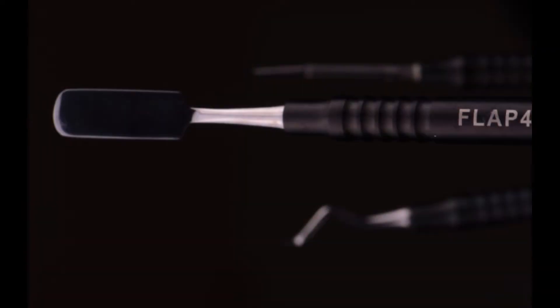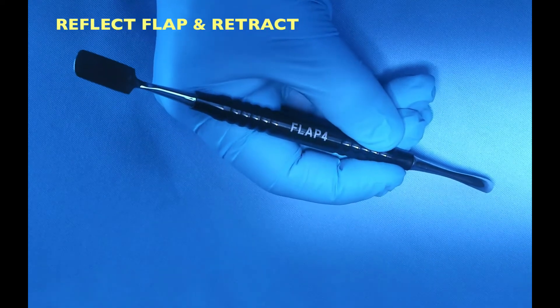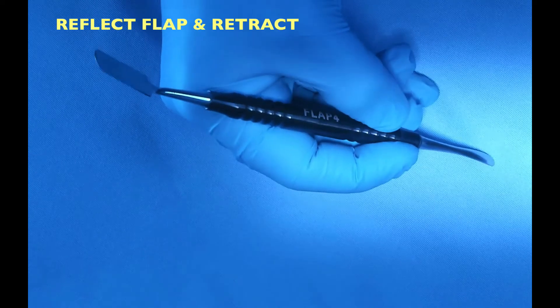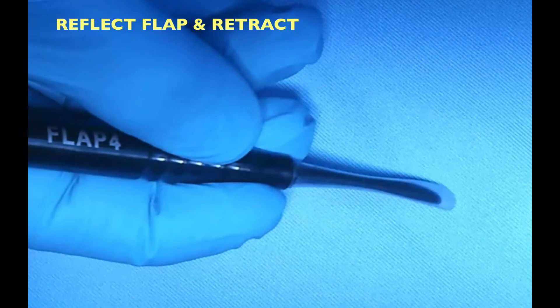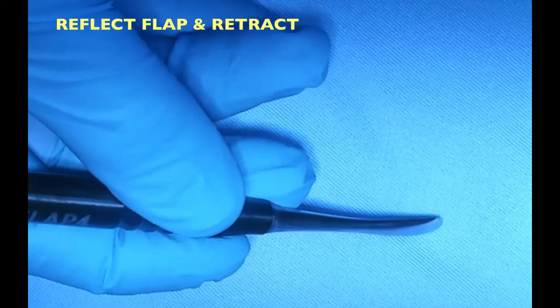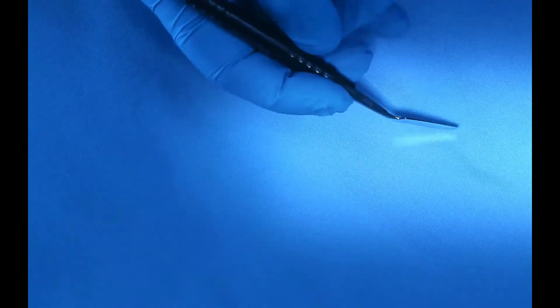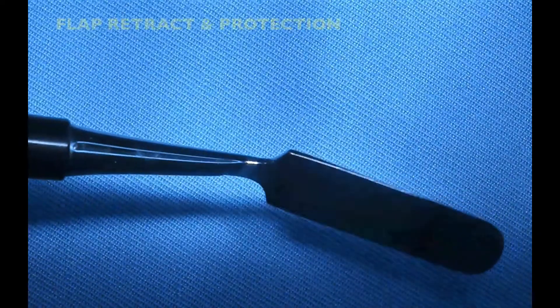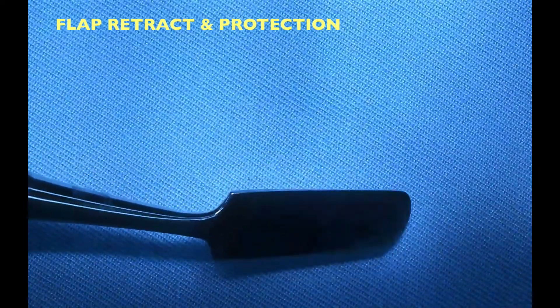The next instrument is the periosteal elevator, with which I reflect the flap — mostly in full thickness. The flat and sharp side is aimed towards the bone so I can have an easier reflection, while the round part faces the tissue to minimize trauma. The other side of the elevator is meant to hold the flap retracted so it doesn't get damaged while I'm doing work on the bone, like osseous recontouring or osteoplasty. It has a wide part that keeps the flap secure — you have to lean against the bone to hold the flap back.